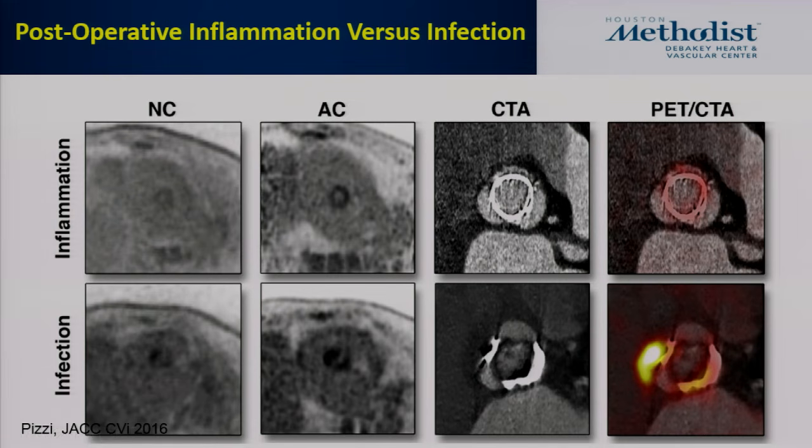What does PET show in the spleen? Anything? If there is infection and abscess, yes, we can see it, if we can cover it. So, a related question: in our lab, how often do you report the spleen, looking normal or not normal? Because when we see lesions, typically on the aortic valve, we're making decisions around going to surgery or not, native or prosthetic, small lesion, big lesion, evidence of emboli. We've argued in the past that if the spleen has an infarct, the lesion is prone to embolize, and that they should go to surgery.